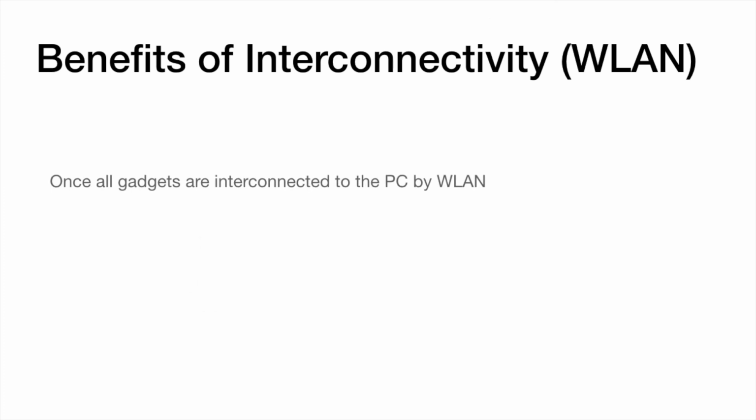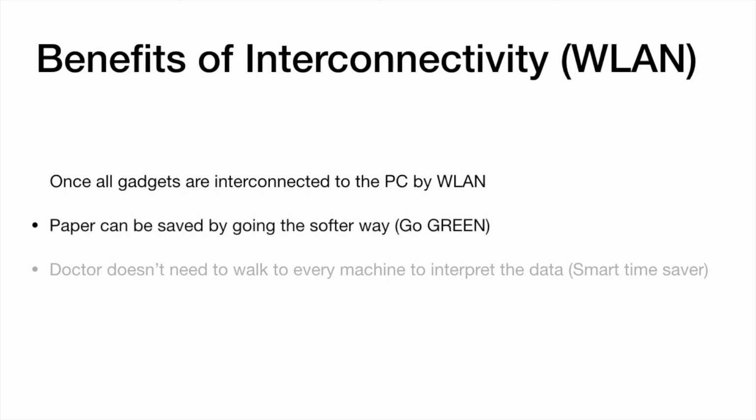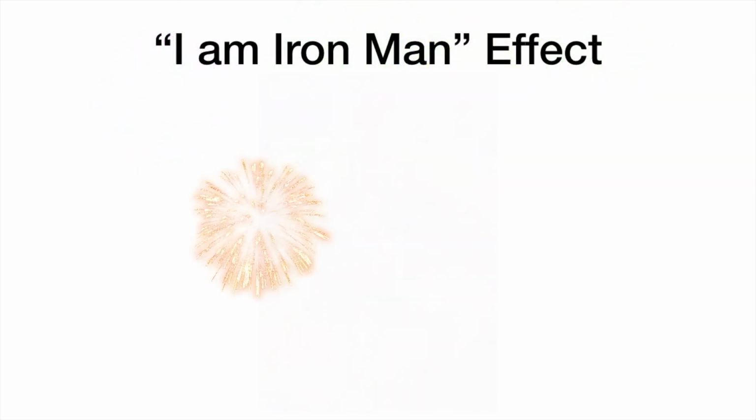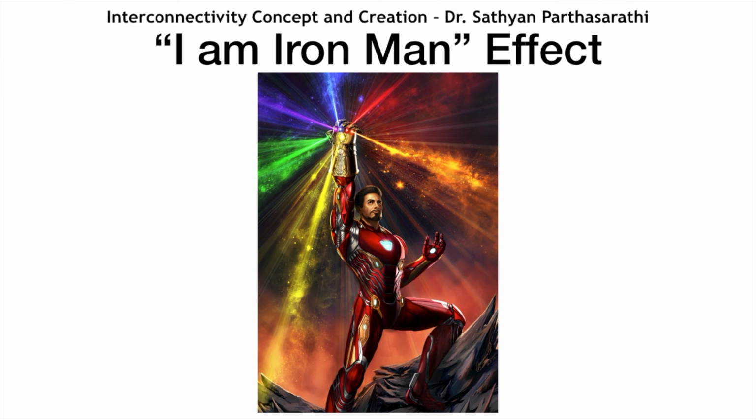The benefits of interconnectivity through LAN are that paper can be saved as we are going the softer way. Doctors can avoid their walking time to the machine to interpret the data and can save time, and we can explain to the patient by showing their own image, which is a very effective practice pattern for counseling. So, the 'I am Iron Man' effect can also be experienced by us ophthalmologists by wielding our infinity stones, interconnecting them through LAN for effective practice.